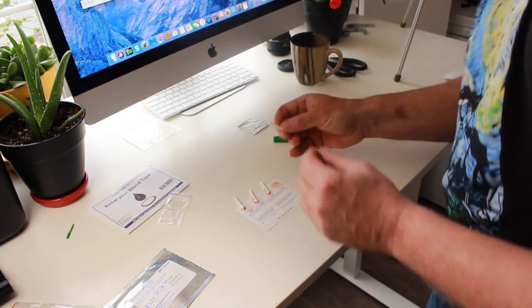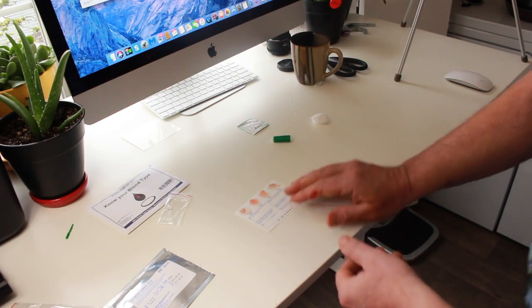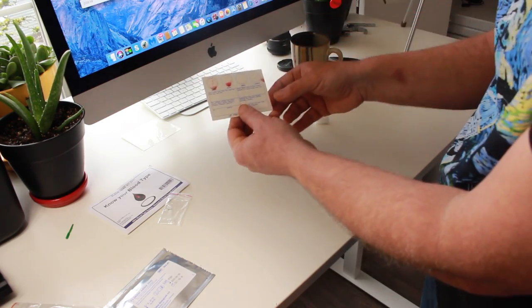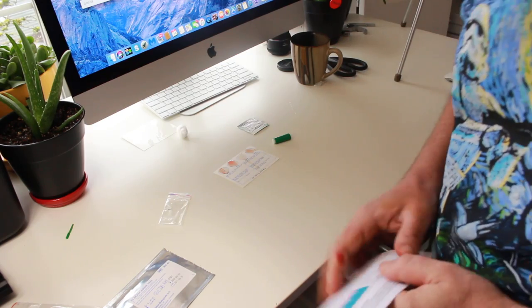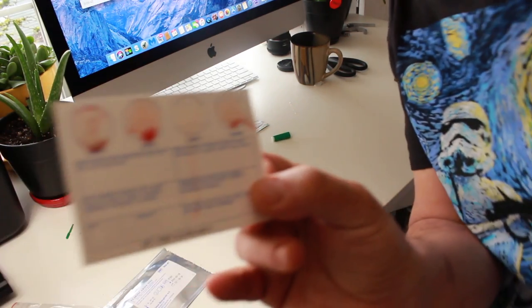Okay, so now I can throw away these sticks. If you can notice, there's one of these that's already reacting. My blood's just dripping right off. There's one of them that has a reaction. It's pretty conclusive, I think we can tell. I don't know if you guys could see that. We'll put it up for you guys there.